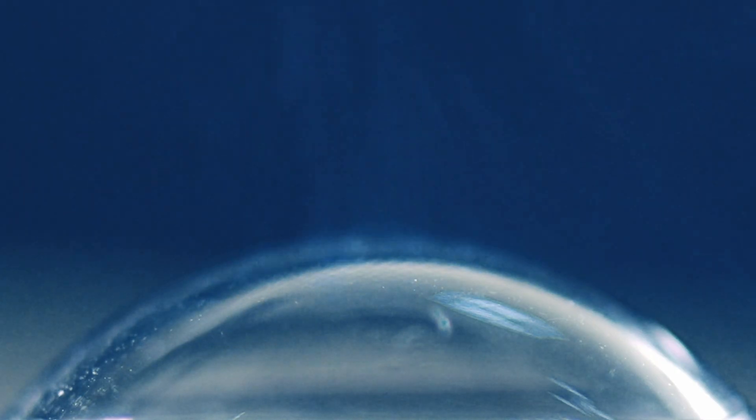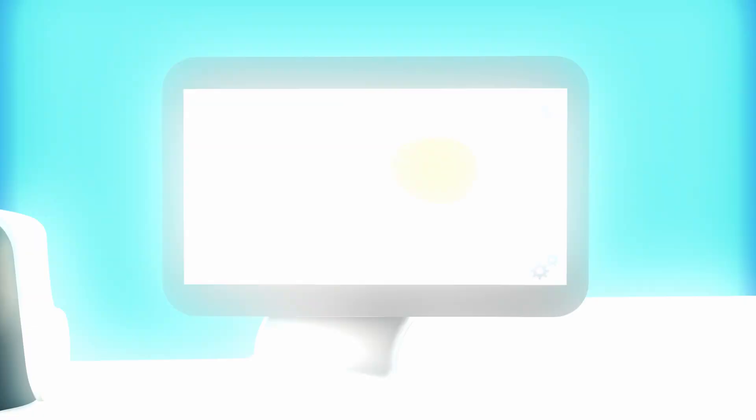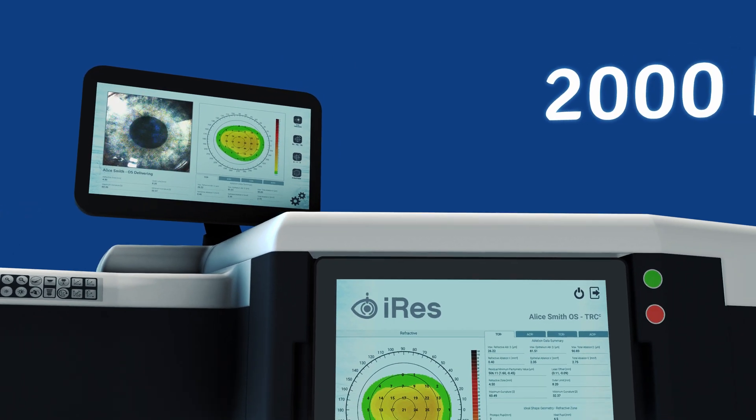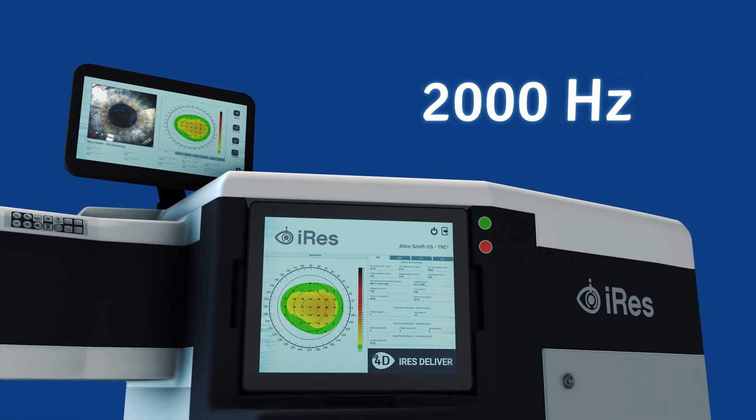iRes 2 is the fastest market available Excimer laser which, employing the IVIS double beam patent technology, allows it to reach a frequency of 2,000 Hertz.